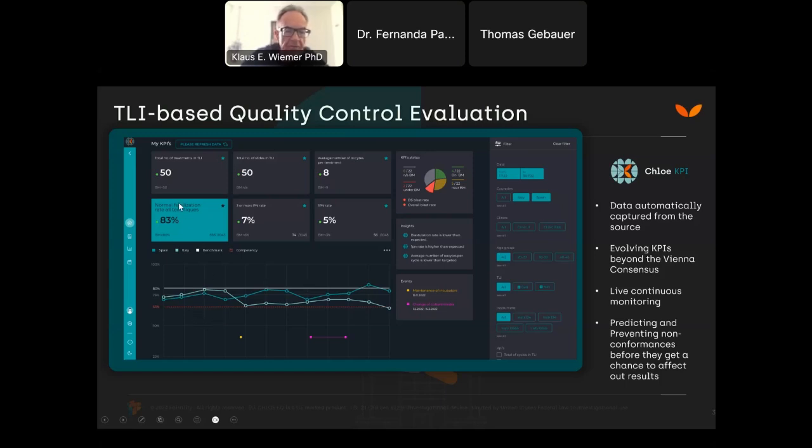And what you can do is you can see, for example, what the fertilization rates were during that time and things like that. And you'll be able to look at these variables that we input in the laboratory. So for example, here we brought in maintenance of incubators. During this time, there were changes in culture media.